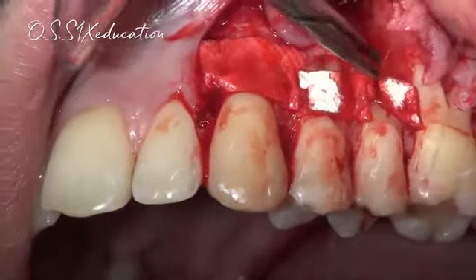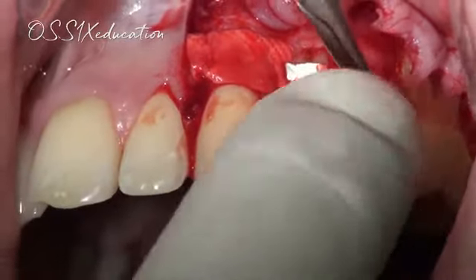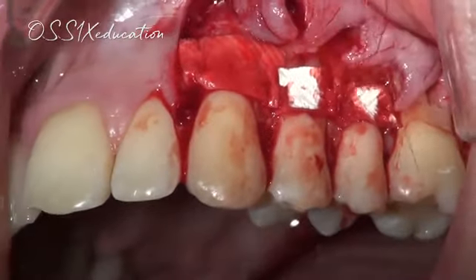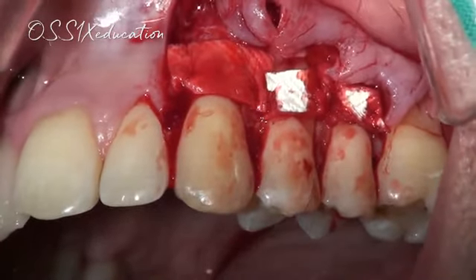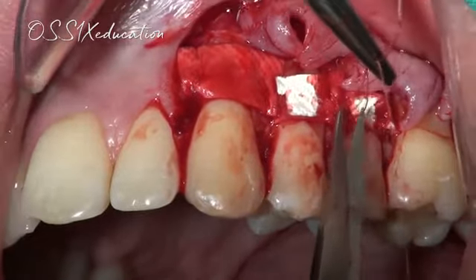Sometimes just hold it gently, really gently. So just remember, don't moisten it and then suture it. Suture it dry. It's much better. It's much easier. And basically it doesn't tear.